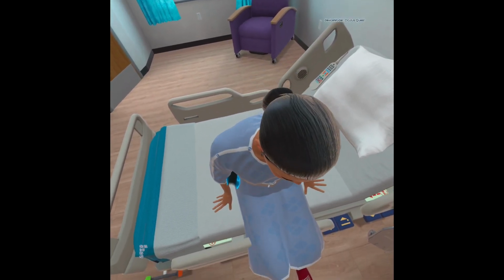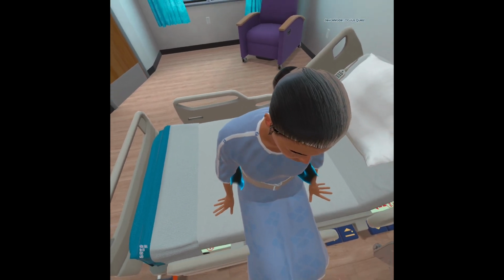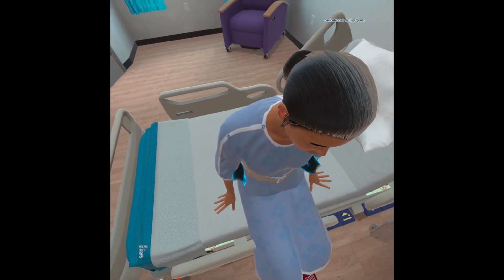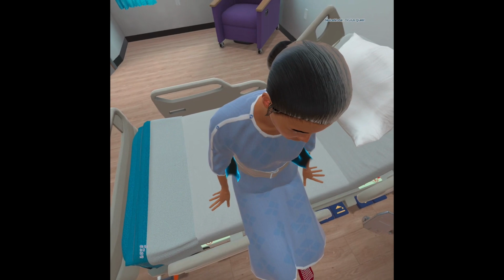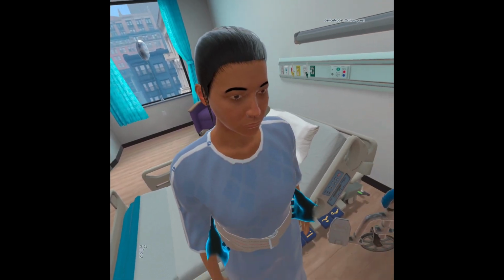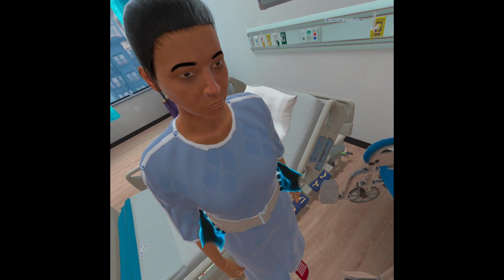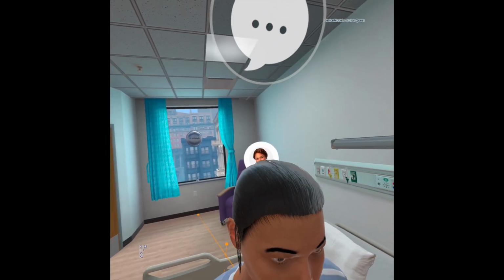Rock forward. 1, 2, 3. Now stand. Good job. What should you do next? The belt still fits snugly. Position yourself to transfer Heather. Let Heather know we'll help her into the wheelchair.